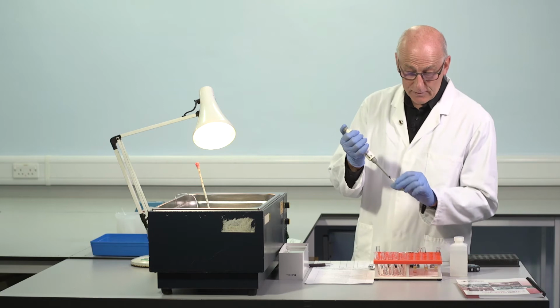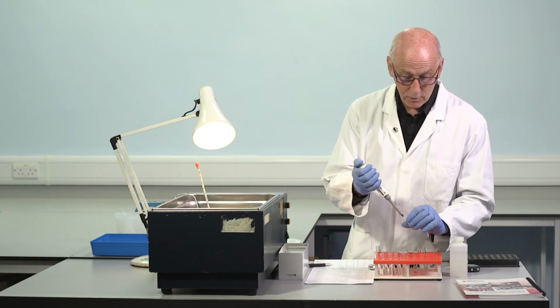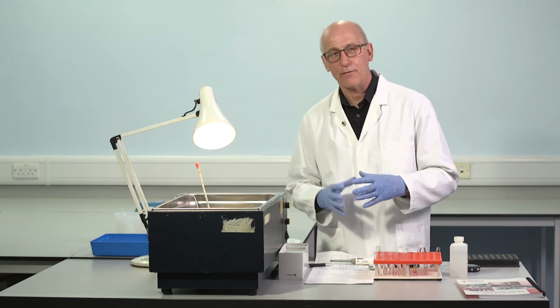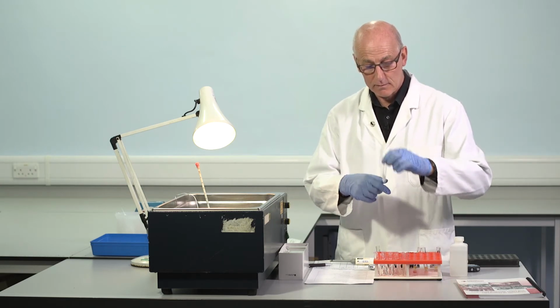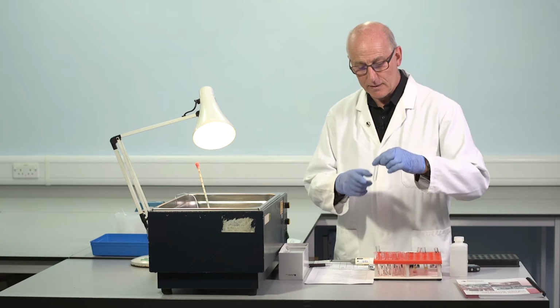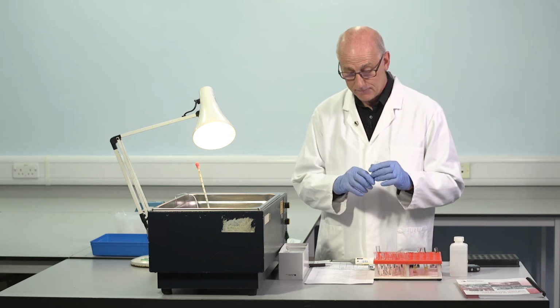So 3 dilutions means, of course, 3 different concentrations, each one containing progressively less factor VIII. Therefore, when we add this to the factor VIII deficient plasma, important to mix, we'll be adding different concentrations of factor VIII.